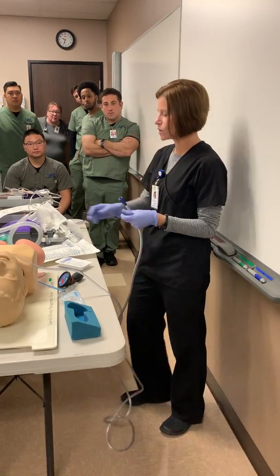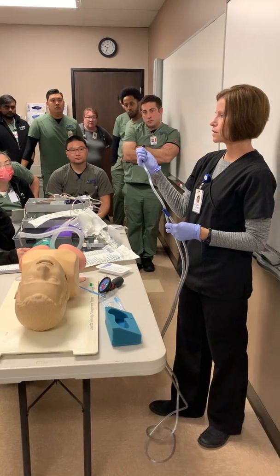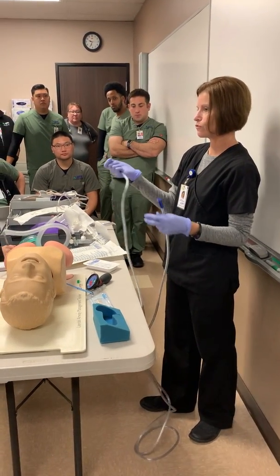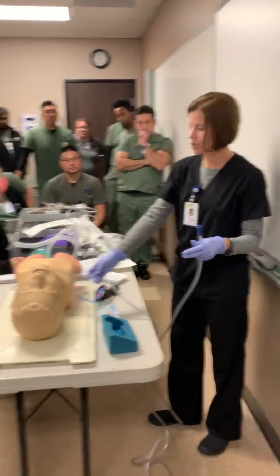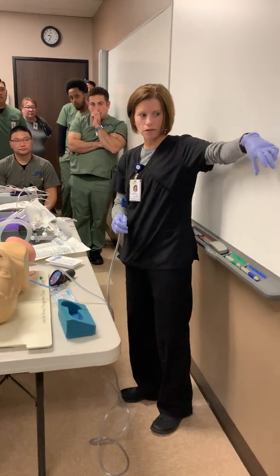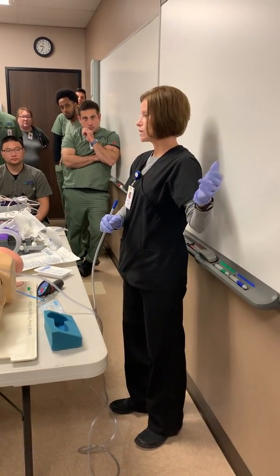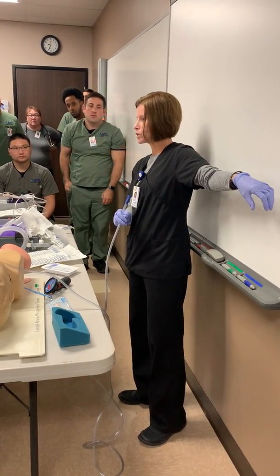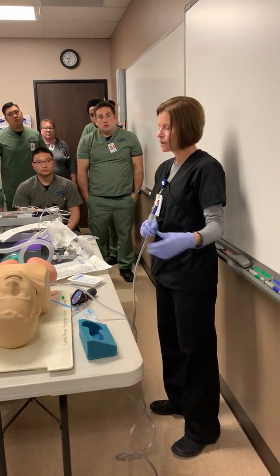The best way to know is if you put your finger here, you're going to hear it make a suction sound, or you're going to feel pressure. If it doesn't come on, there's a couple things to check. One, make sure that on the top of it there's a dial and it'll say regular, full, or intermittent. We want it on regular. At the base is where you adjust the pressure, because maybe the pressure isn't set to that negative 100, 120.